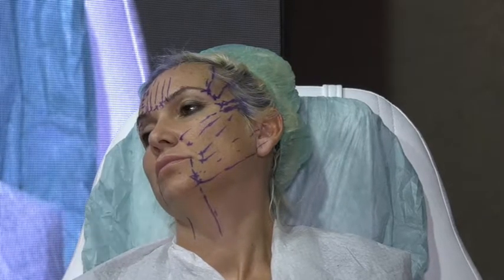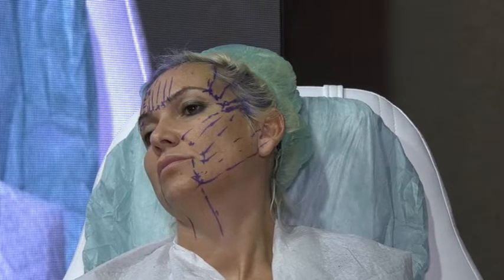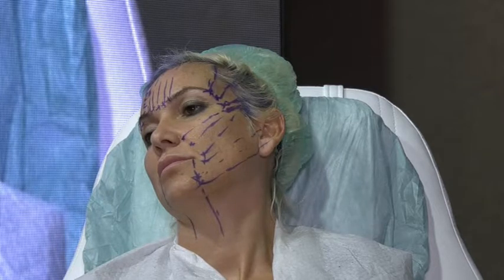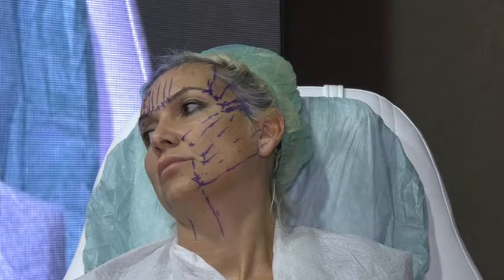This is also a big conflict with a lot of people. They ask me, why don't you put a thread in the middle? Why don't you do the crisscross technique? Because I believe that in lifting, if I want to lift this area, I should take the laxity out away from this area. So I don't do the crisscross.